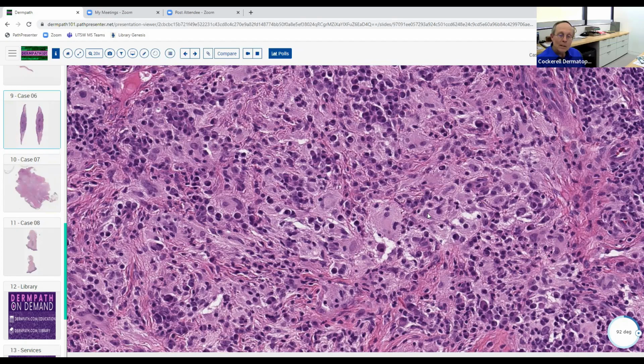You get histiocytes that have asteroid bodies in them and that sort of thing. So these are probably just multinucleated, large histiocytes, not otherwise specified, I would say, but they don't have any characteristics of, say, a Touton giant cell we might see in a xanthogranuloma, for example. Is there anything else about these histiocytes that you notice?